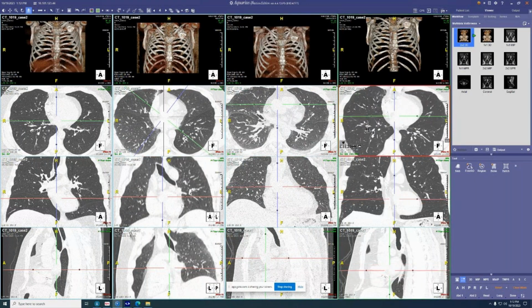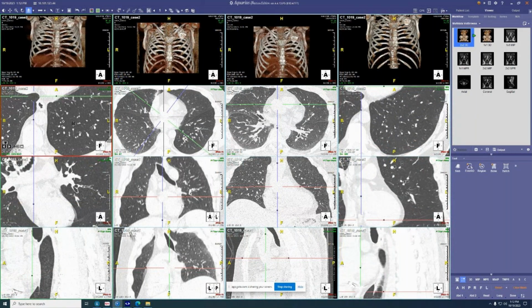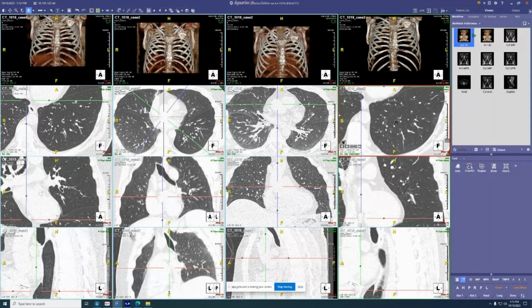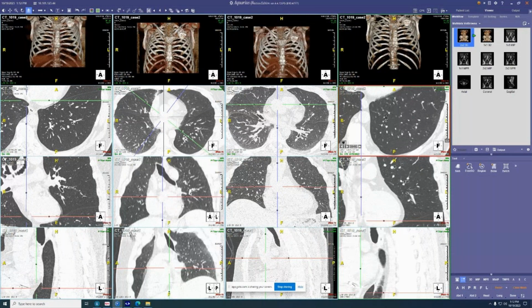That's great. I think it's probably a sampling problem, Seth, because if somebody gets better, there's no incentive to do a repeat CT. So you got lucky this time because they got you one. But normally you wouldn't see the improvement on the dilators. Yeah, this was many months later, and they switched all his meds around. I don't know exactly what they did, but looking at the history, he was severely symptomatic here in January, and he was symptomatically much improved on this follow-up.